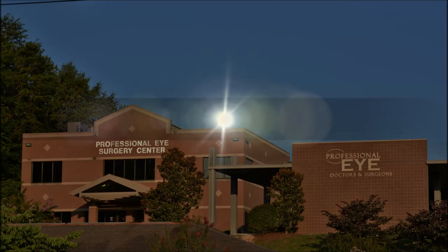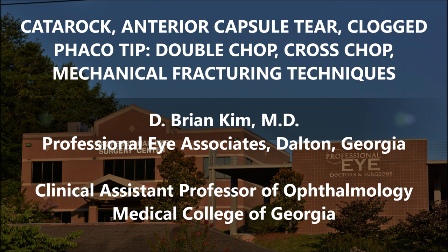Hi, this is Brian Kim. I'm going to share with you this case of a very dense cataract and performing double chop, cross chop, and mechanical fracturing techniques.